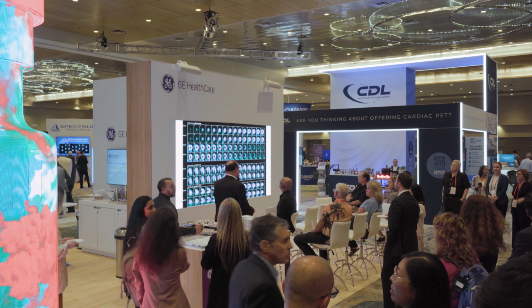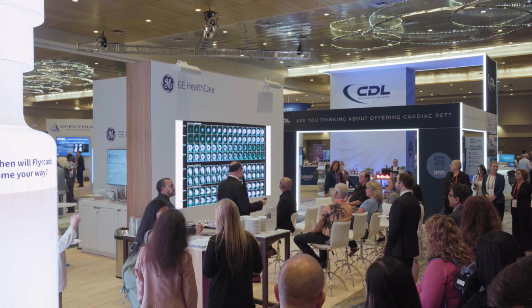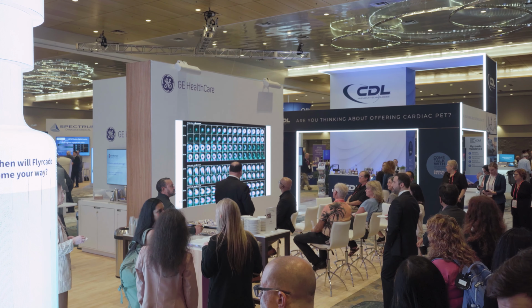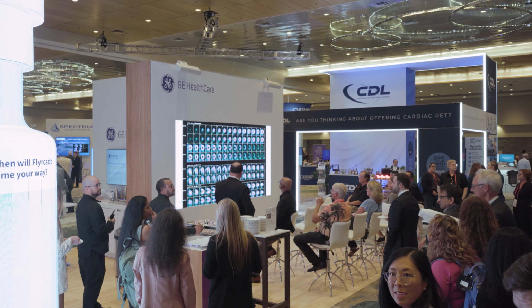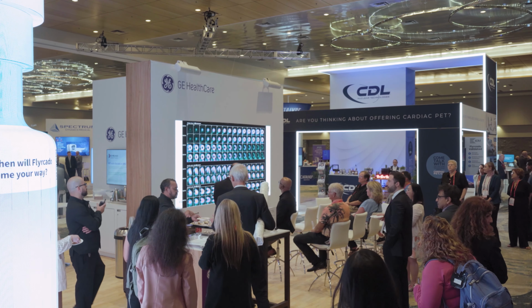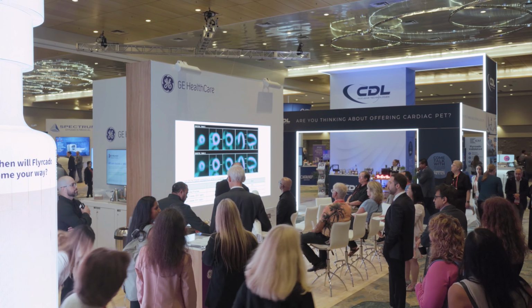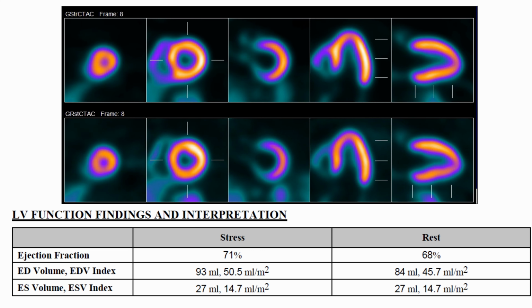And this is not because of something pathologic. The apex itself is thin, so we see it more pronounced here. And you can see here it's normal without any perfusion defect. All right, these are the gated images, and it kind of confirmed that this is apical thinning.